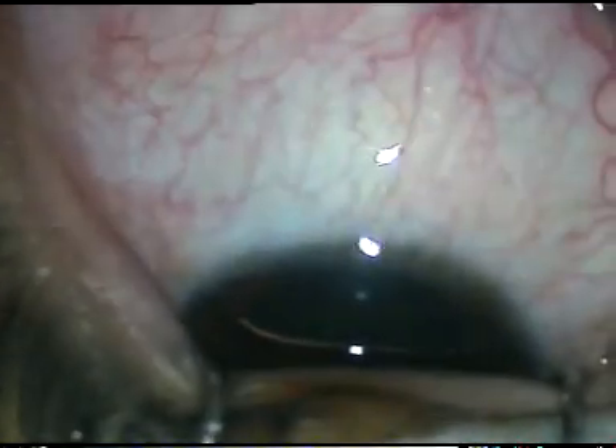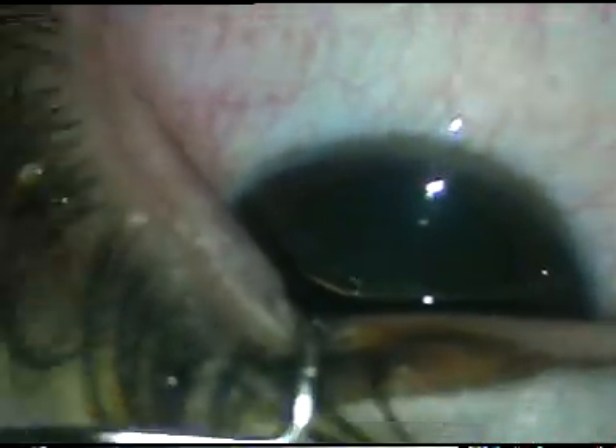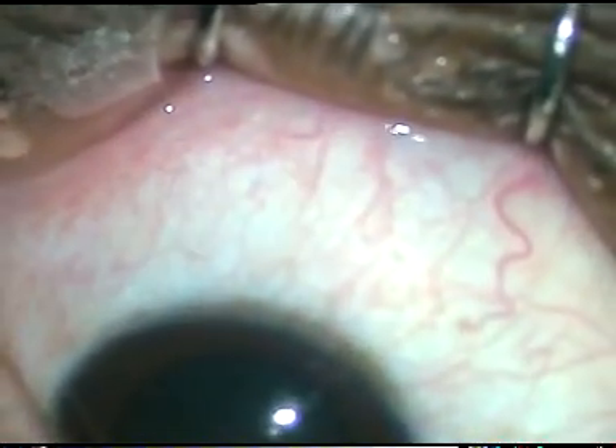After a thorough wash of the ocular surface — in India we inject anti-VEGF in the operation theaters. This is Ranibizumab from Intas Pharmaceuticals, marketed as Razumab. This is 0.1 mL in a tuberculin syringe.